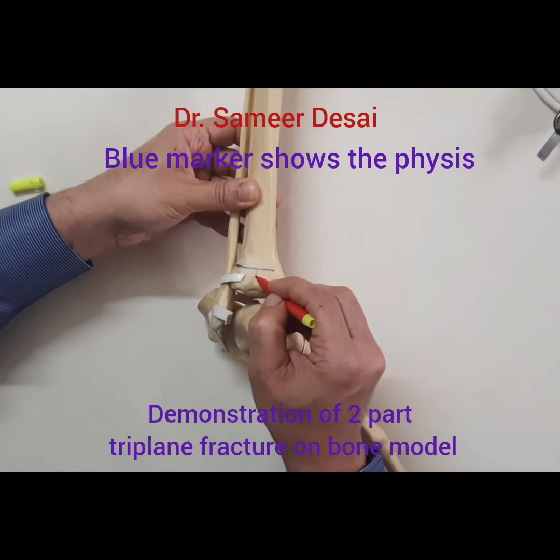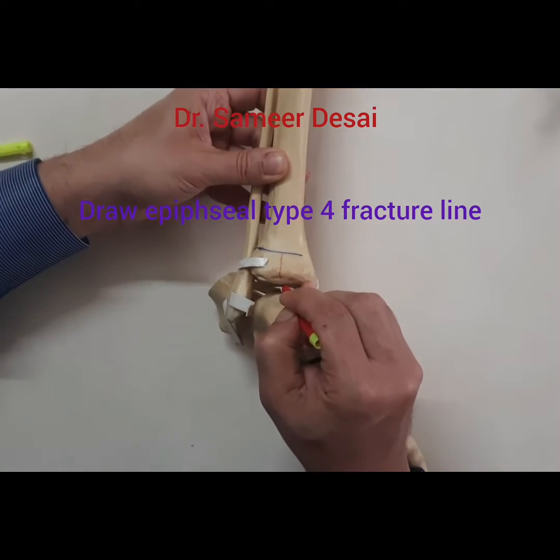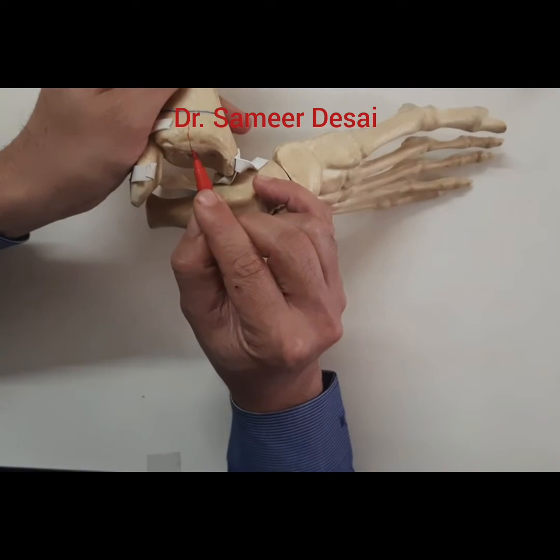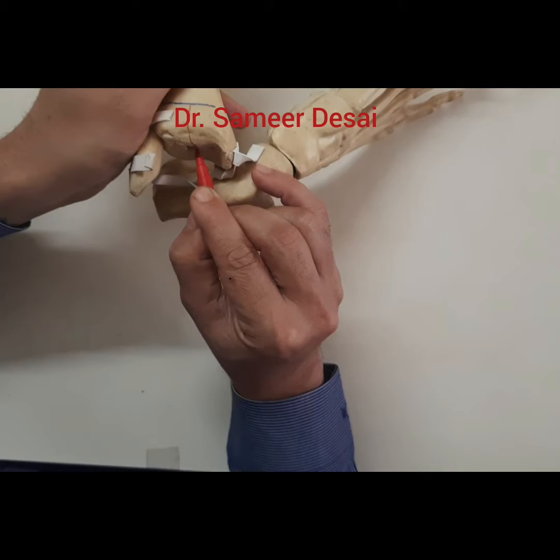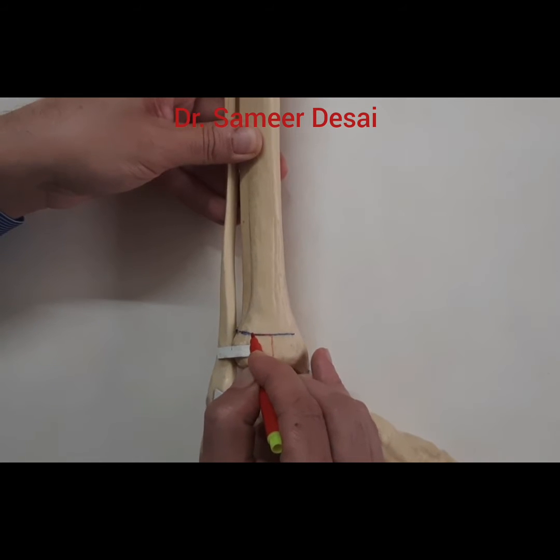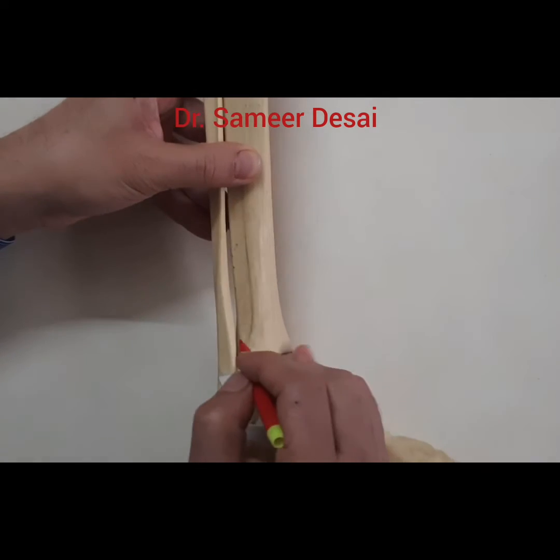I am going to demonstrate a two-part triplane fracture on a bone model. The blue line indicates the physis. The red line is drawn along the joint and in the joint. Then a line is drawn from the center of the epiphysis to the lateral part of the epiphysis.